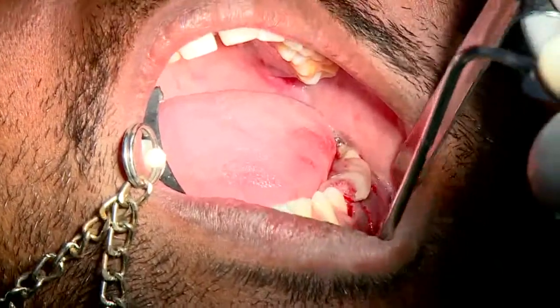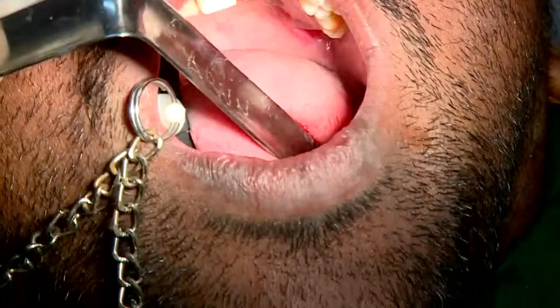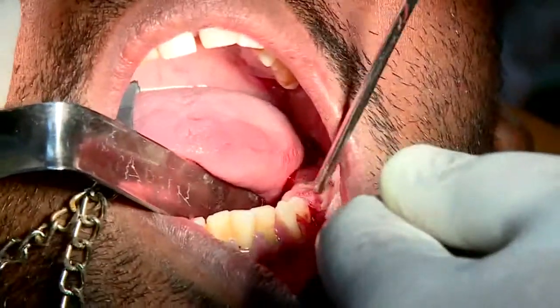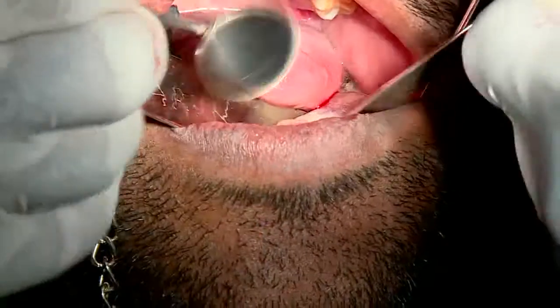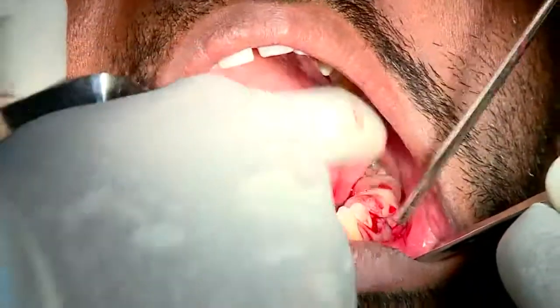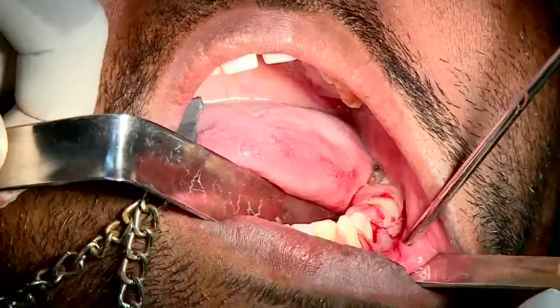So can you guys see the position of that splint? Yes, sir. It's a very simple one, and all of you have done so much prosthetic work. We have very advanced splints nowadays, a lot of digital splints. Dr. Yasser and Dr. JK can throw some light on it. When people are missing multiple teeth, we do a lot of planning. As I told you, implant is more about planning. So we should know where to position our implants.